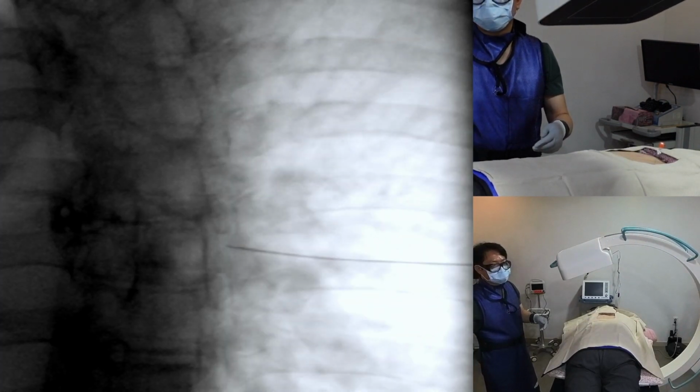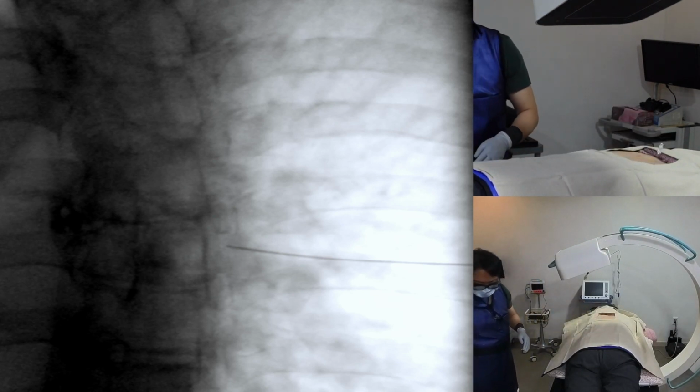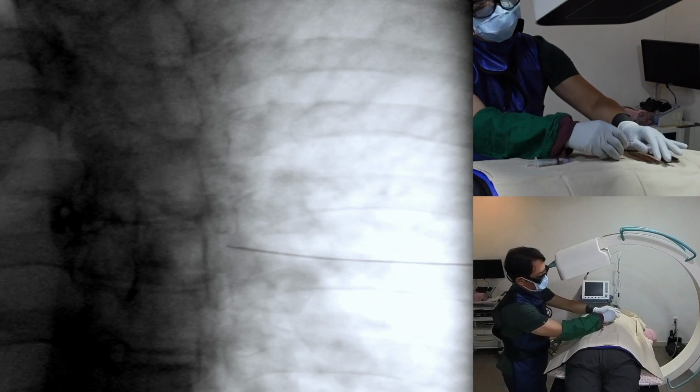However, the contralateral oblique image shows a clearer view of the pedicle and a tangential view of the lamina, which helps determine the proper needle depth.